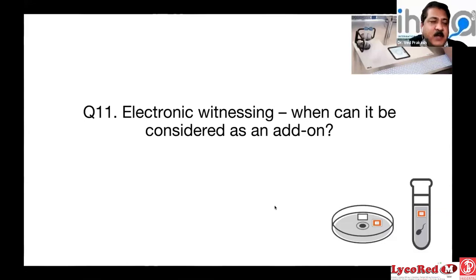Yes. When you align the tags, the number of tags for each process differs. For example, some labs use 5, some labs use 10 for very important steps. This alignment is very time consuming. Here, as you rightly said, we also need manual witnessing. One person says, so on XYZ patient, and this XYZ patient has to be typed into the system. Then you have to align a tag. Once it is done, the next part is a cakewalk, but this aligning will take time.